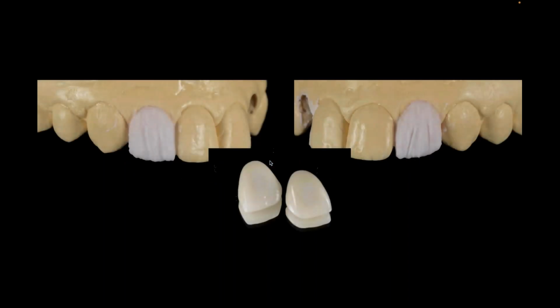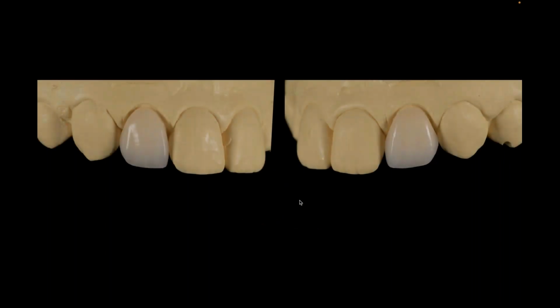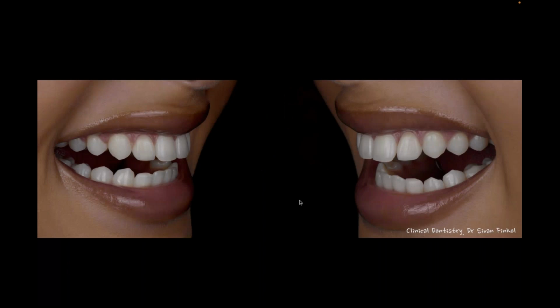And then I'll finalize that with my enamels, and I'll finalize those veneers. In the end, I'll try to make them look as thin as possible to manage the space, but I think I would have been better off with a little window veneer on the cuspid, and we'll send those back for insert. And in the end, they worked. Again, from the lateral view, they look a little wide, but when you see her up front, it really works, right? That's really what she wanted, to manage that space a little bit better, so when she smiled, she didn't feel conscious of it. And that's what we'll try to do.